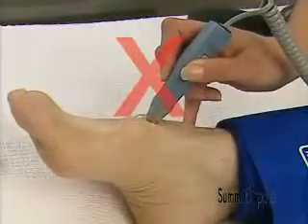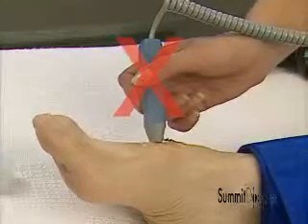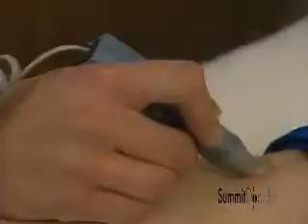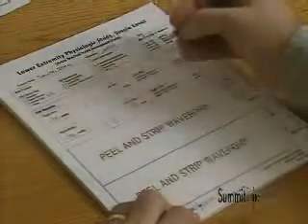Here's an example of improper technique. Angles like this should be avoided. Remember to use the proper 45-degree probe angle. Now we are ready to complete the LifeDop ABI report form.